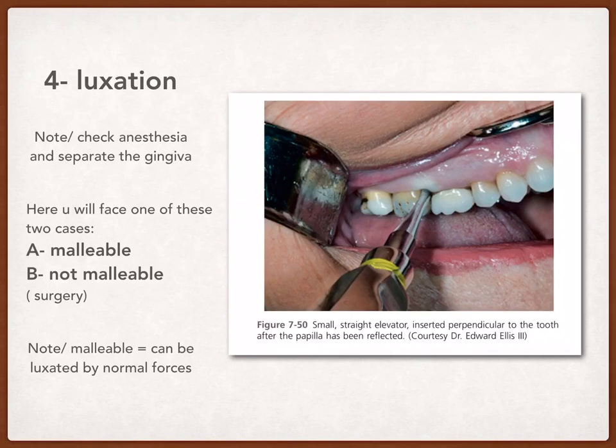Guys, when I say malleable, I mean the tooth that is not stiff and that can be luxated by normal forces. But the not malleable teeth are the stiff teeth that cannot be luxated by normal forces and should be extracted by the surgical technique and by the separation of the tooth if it is a multi-rooted tooth.